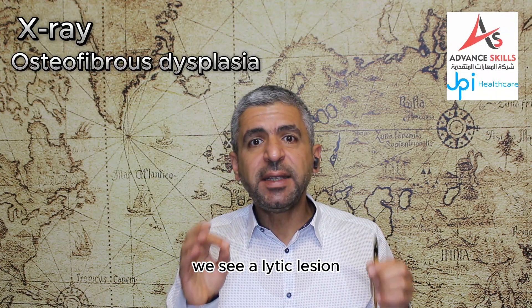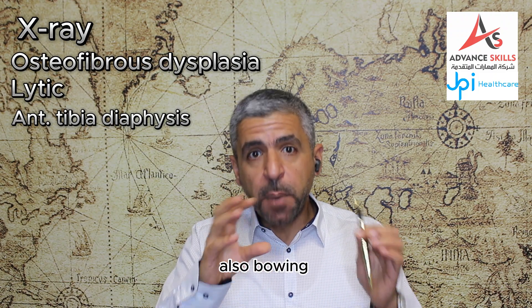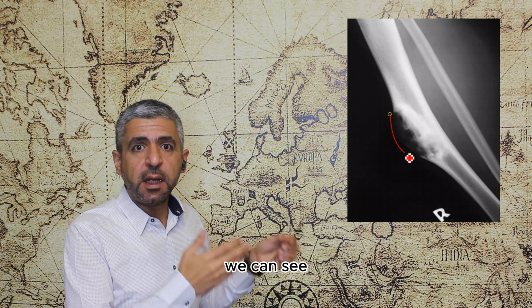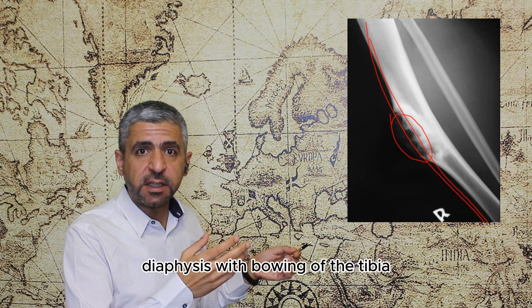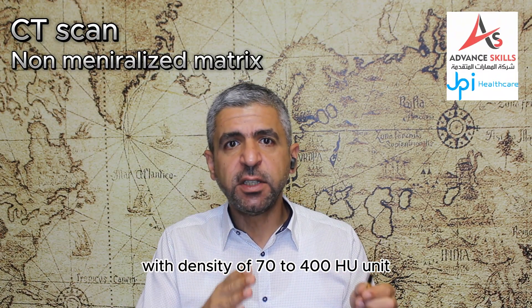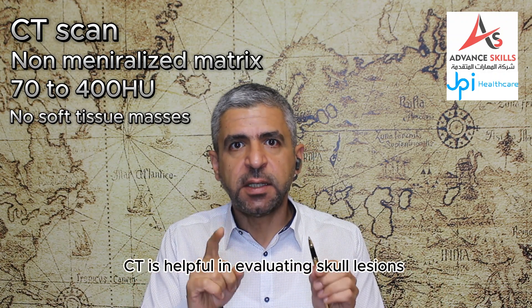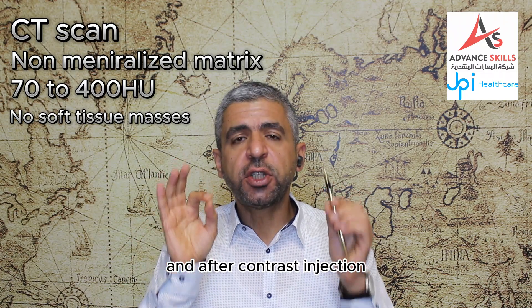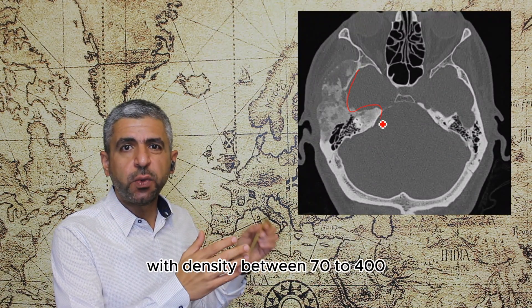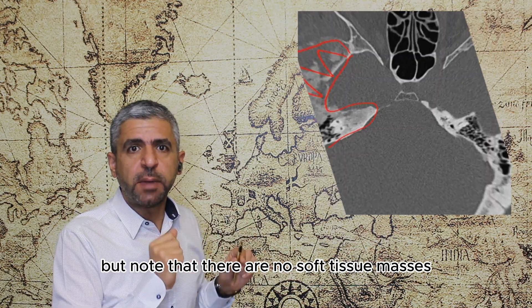In osteofibrous dysplasia, imaging shows a lytic lesion in the anterior cortex of the tibial diaphysis with bowing. On CT scan, lesions show a non-mineralized matrix with density of 70 to 400 Hounsfield units due to microscopic calcification, but there are no soft tissue masses. CT is helpful in evaluating skull lesions, and after contrast injection, enhancement of active lesions is seen.